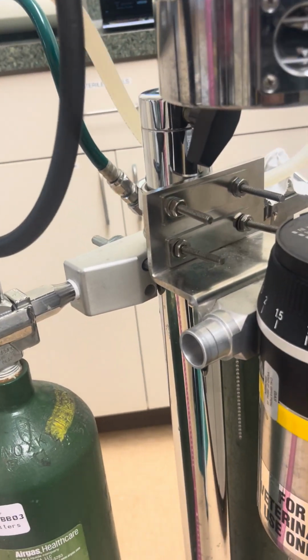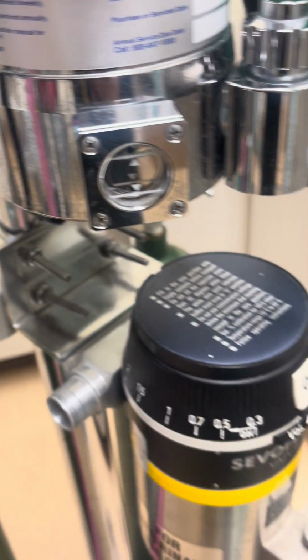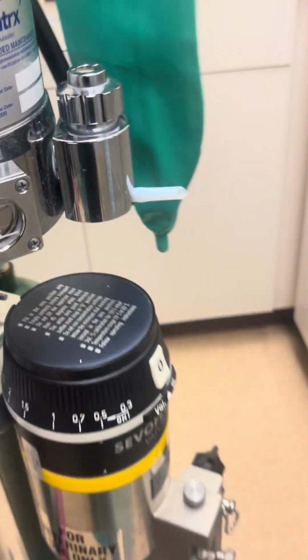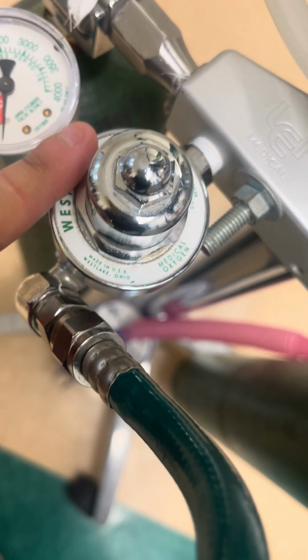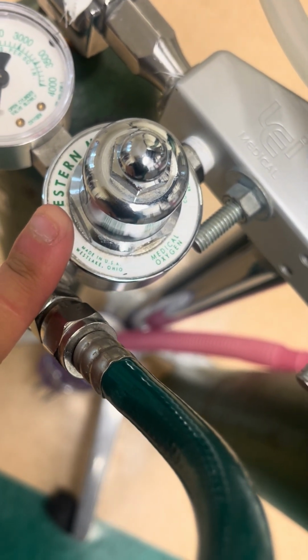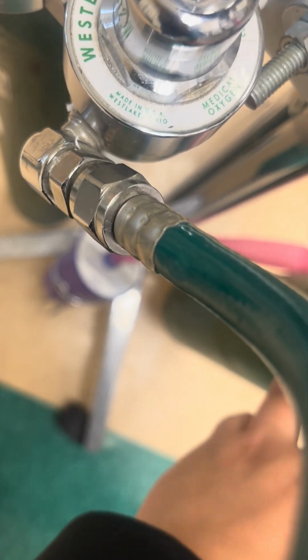Right, our third step is the pressure reducing valve. Let me turn them around. This guy right here is your pressure reducing valve. It reduces the pressure of the gas coming out of the compressed gas cylinder from 2200 psi down to about 45 to 50 psi. It also makes pressure low enough that it is safe for the anesthetic equipment, but not safe for the patient just yet.